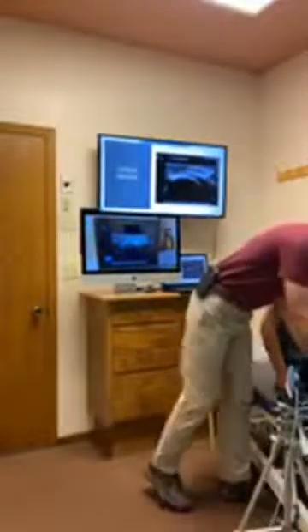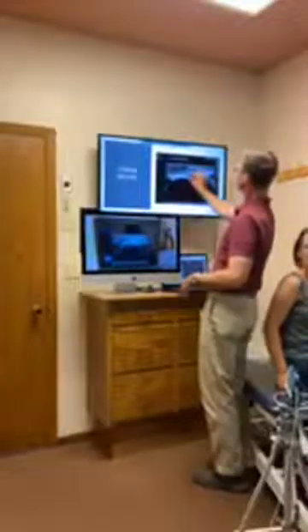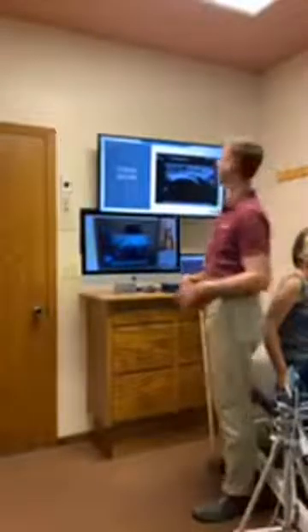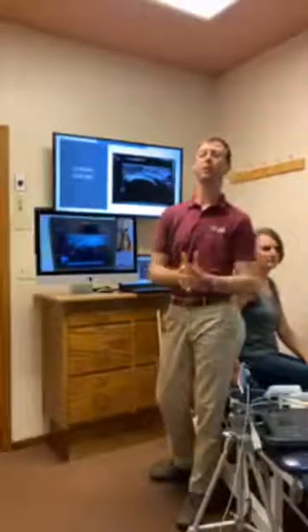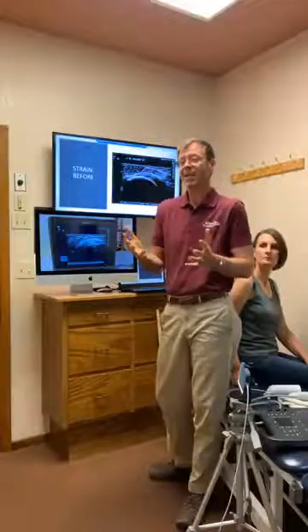So here we have a strain of the supraspinatus tendon, and you will notice right here, this doesn't look too bad, but right up here we have this black area, or hypoechoic area. That's suggestive of essentially a partial tear. So strains are graded in different grades depending on the severity. Everything from a mild strain, damage to the cellular level, to partial tears, to a complete disruption of the tendon. Obviously that would be a significant strain, but that's a strain.